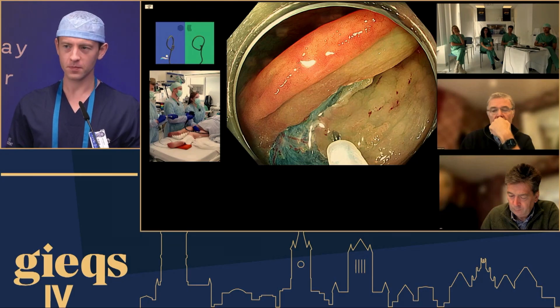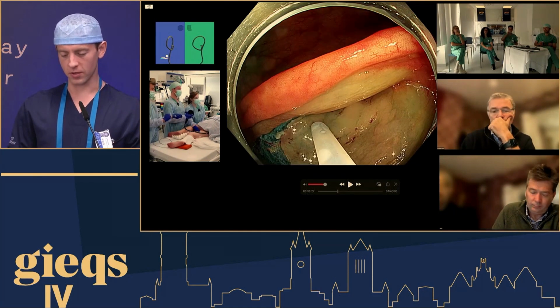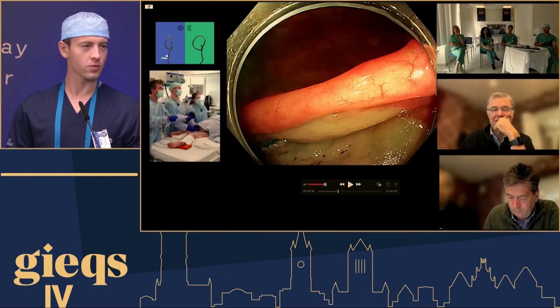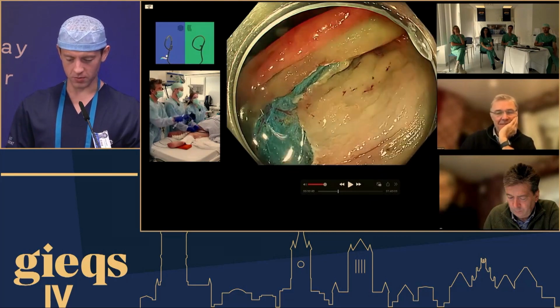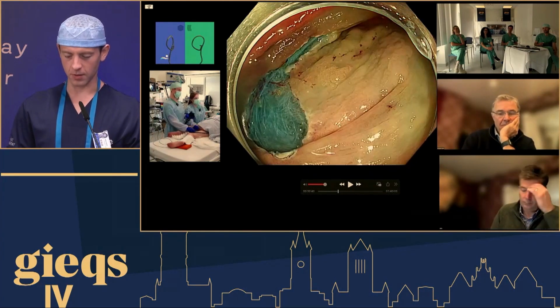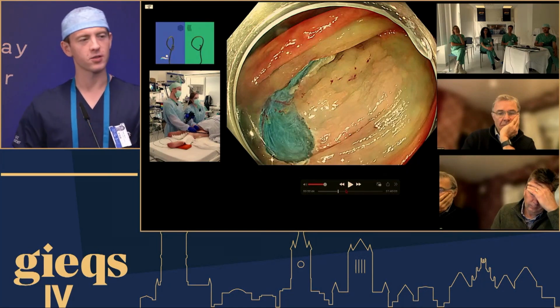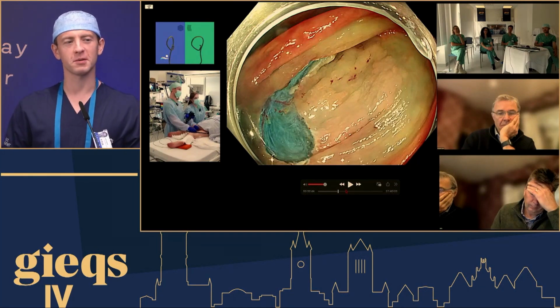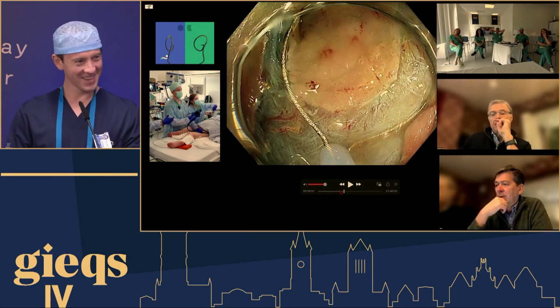So can you be clearer? Yeah, can you be clear? So I actually ended up with an over-injected lesion, which was even harder to resect. Yeah. So this was to drive home that point. You see that it's actually quite injected. Then John commented, well, yeah, it's in the cecum. It will diffuse quite rapidly, just to maybe save my honor a bit. Yes. So he was on your side.